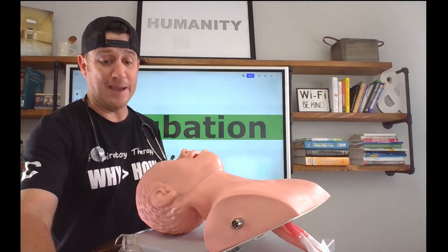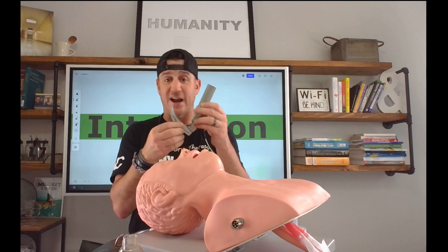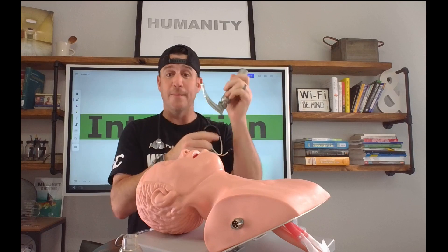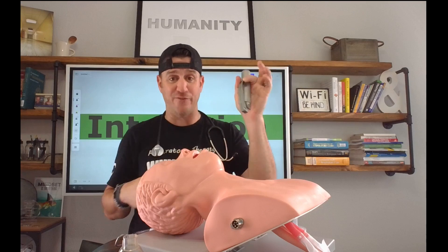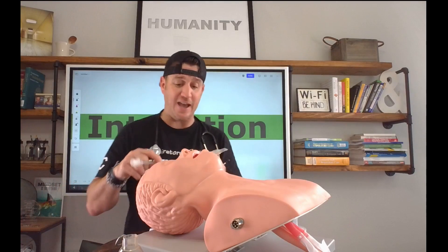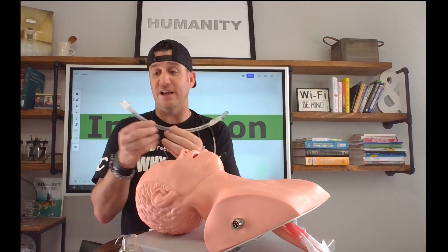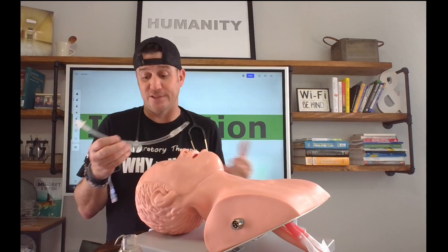So Ambu bag and mask. We talked about our laryngoscope and our blade in the last video. I'm using a number two Macintosh. My light is working, so I have a functional laryngoscope and blade here ready to go. I'm also going to have my endotracheal tube of choice — I'm using a 7.0 today, maybe a little small for a male, but this is the tube I have, so this is the tube I'm using.